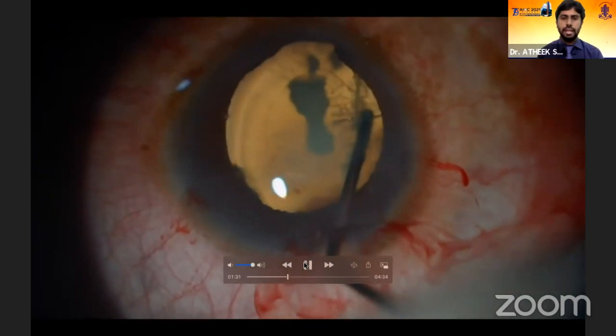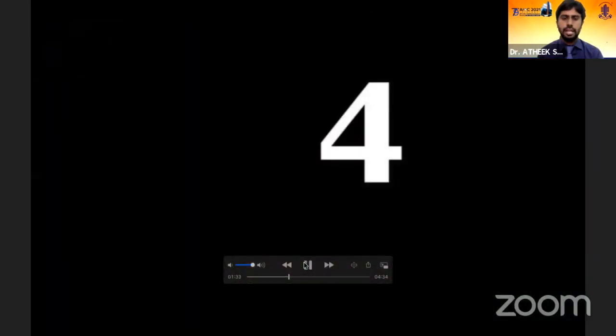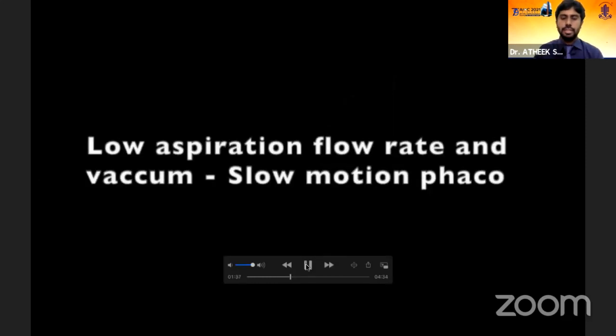This being a soft cataract, we did a gentle hydrodissection, as well as a delineation. This step is very, very crucial. Before you start your phaco, it is better to do everything slowly. At maximum, we will be spending about 2 to 3 minutes more inside the eye, which is really worth it and will give brilliant results post-operatively.